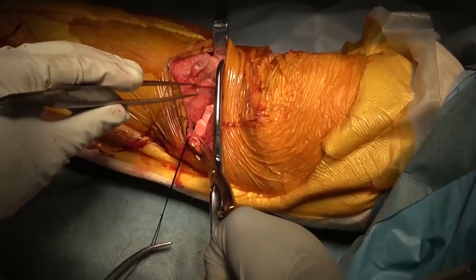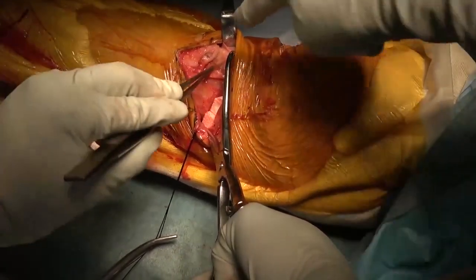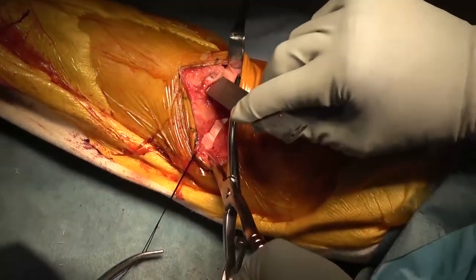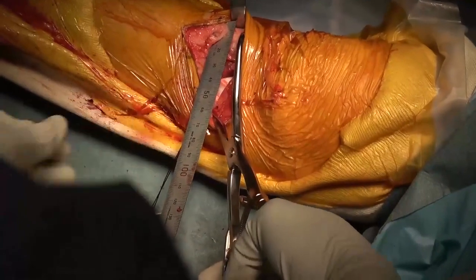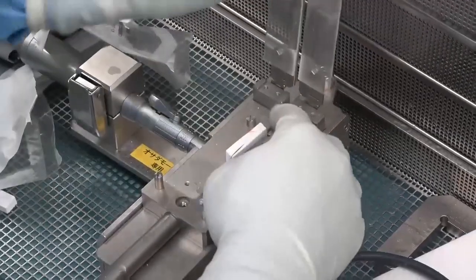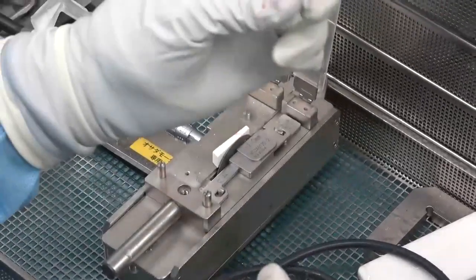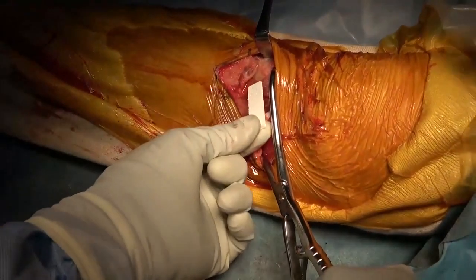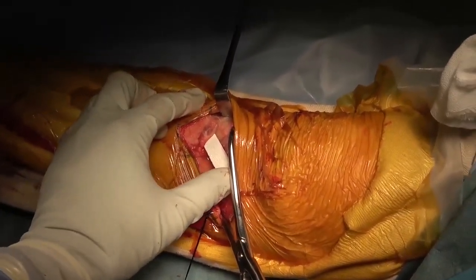After completing all osteotomies, the transverse gap is opened to the intended corrective angle, while crimping the retrotubercle plane with a bone grasper, and is filled with beta-TCP blocks. If there is any gap in the oblique ascending plane when crimping the retrotubercle plane with the bone grasper, the wedging technique can be employed using a thinly shaped beta-TCP block for additional stabilization.